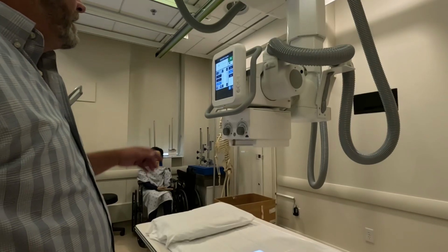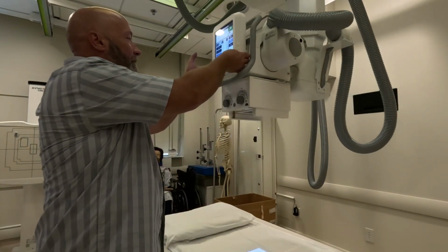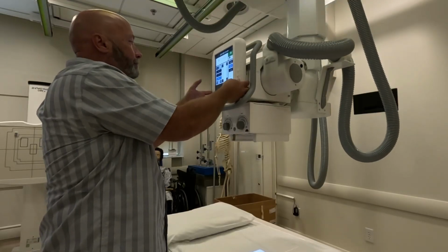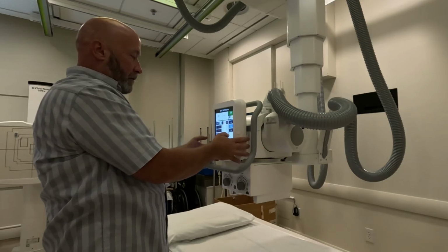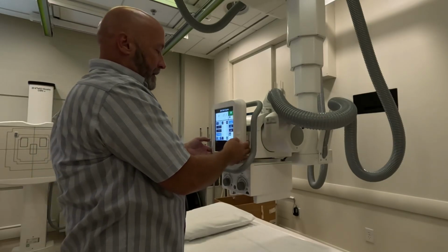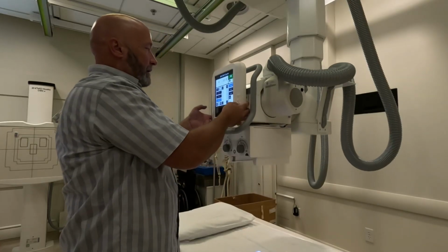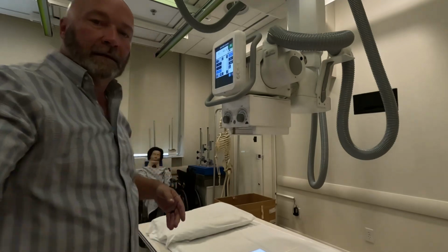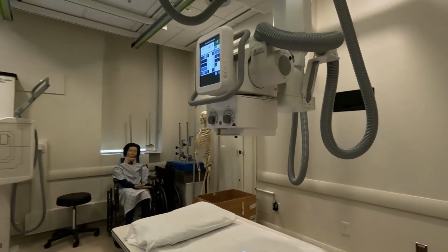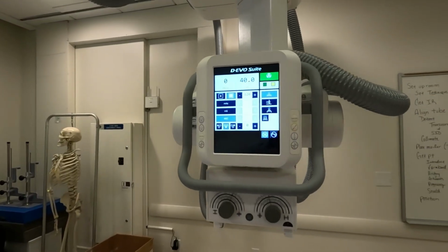So you've got that, but you've also got a detent for 40 inches, or you should have. We're set up on chest x-ray again. If I click this over to table, then it should give me the 40-inch detent. So they're locked in. You didn't get that audible beep, but it did lock in at 40 inches.